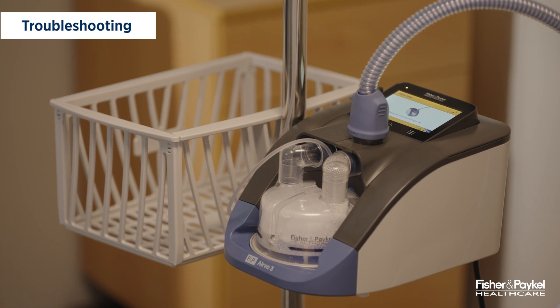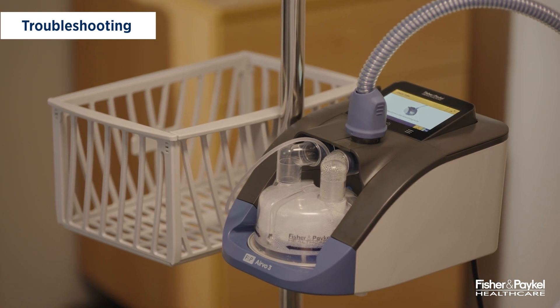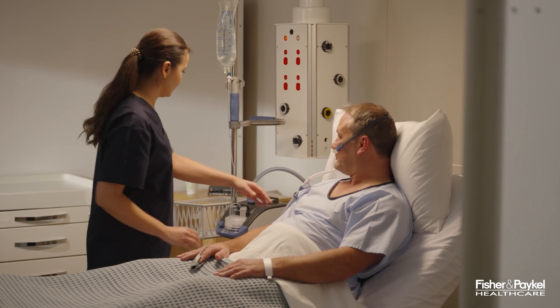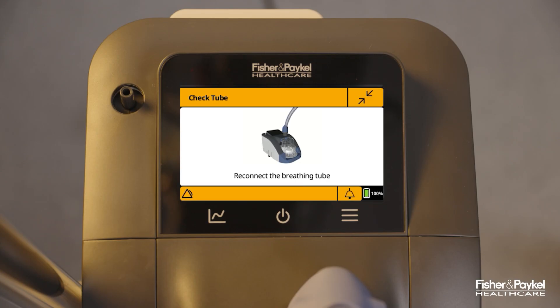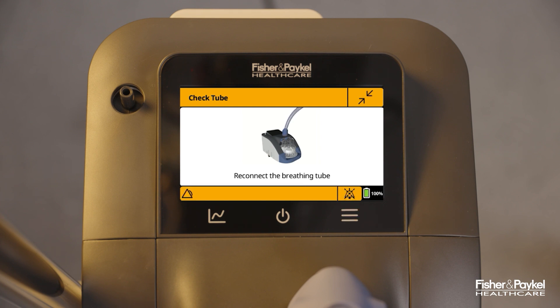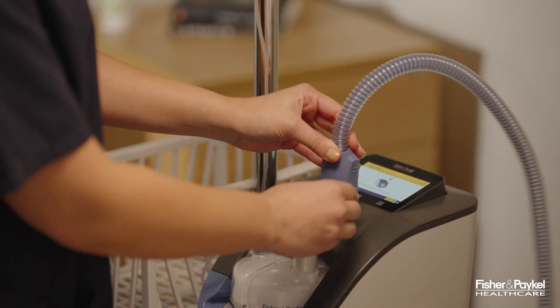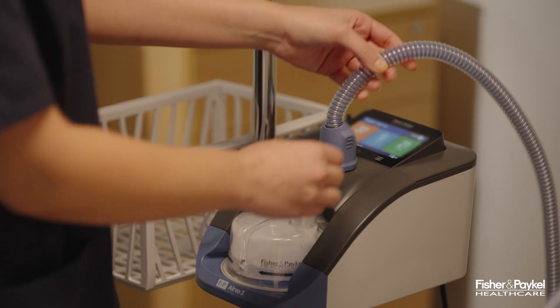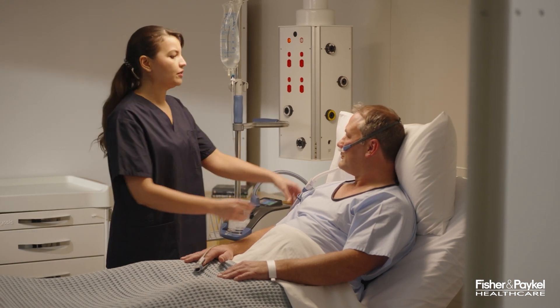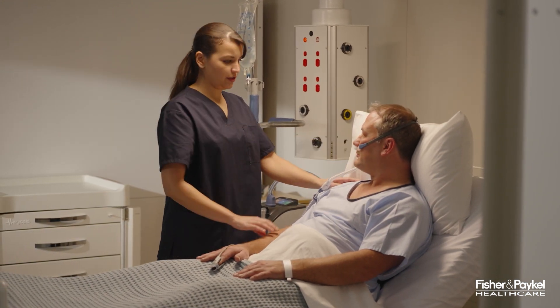The Evo3 has visual and auditory alarms to notify users about interruptions to therapy. The signal light flashes and troubleshooting information is displayed on the Evo3 touch screen when any alarm is active. To temporarily silence the alarm, press the audio pause button. Use the left and right arrows to scroll through suggested resolutions. Some alarms have only one suggested resolution — resolve the issue, in this case a disconnected breathing tube, by reconnecting the breathing tube to the top of the Evo3. Once corrected, the Evo3 will continue to deliver therapy to the patient.